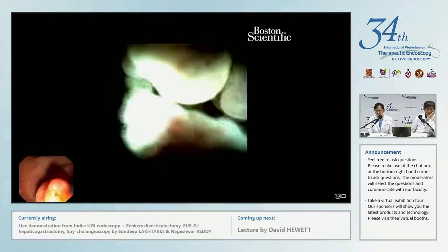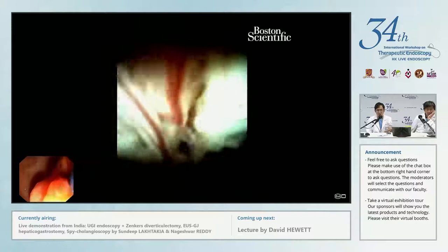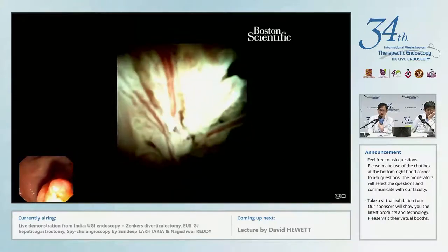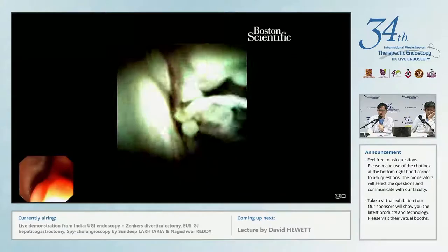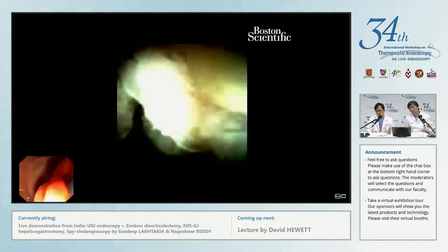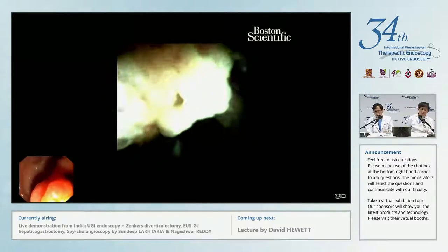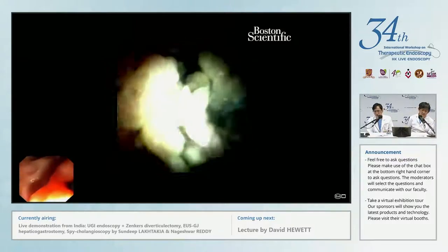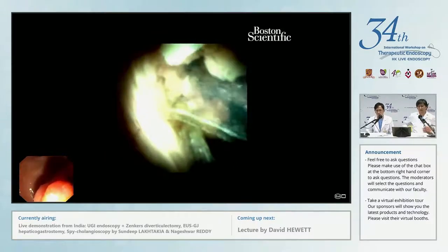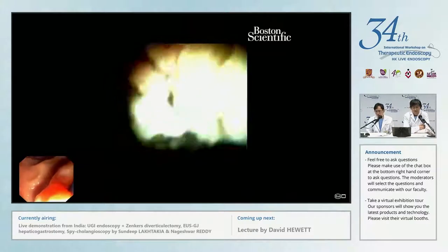Very nice. Actually, you can see those vessels also very clearly there. Wow. So this is a classic case. You can't get a better case than this for showing a papillary tumor of the bile duct. And the good thing is the prognosis is much better than the conventional cholangiocarcinomas because most of them are localized.